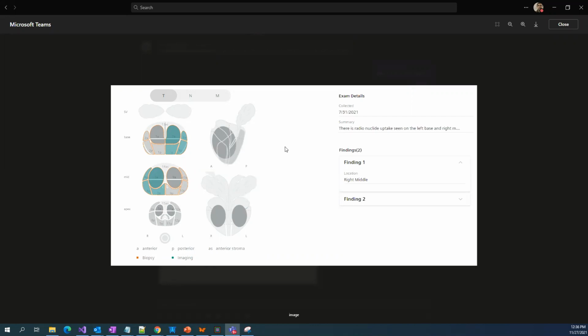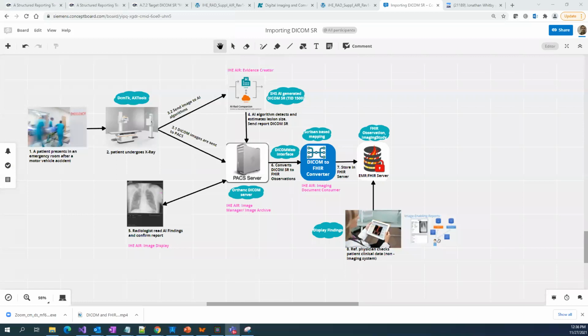I think some experts should be able to detect it in one of these locations. I think the colored one shows the location where it is. I was just trying to map that posterior lateral middle peripheral zone. Anyway, that's not the prime requirement here.